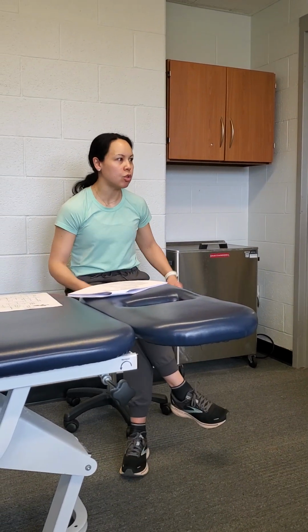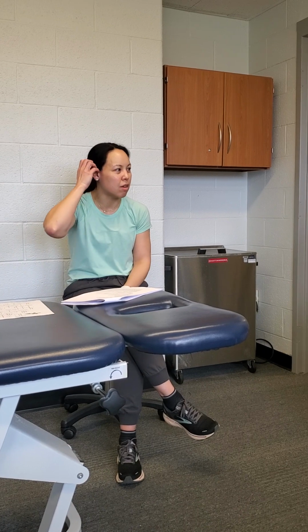I mean, kind of, you could do one or the other. Like I personally will probably do the uninvolved, if that makes sense, especially if we want to train the uninvolved side as well. Or maybe I'm thinking of an elderly frail patient, where you'd say let's see how you feel and then rate yourself on the scale, and that might give you just some more information, but typically I'll probably use the uninvolved side.